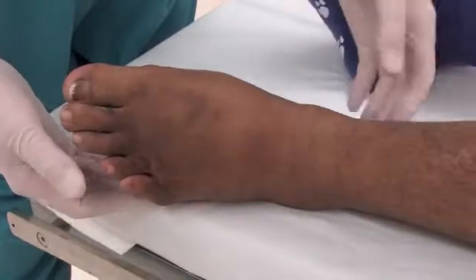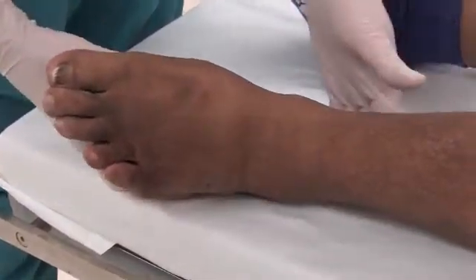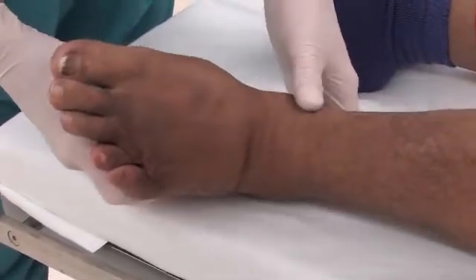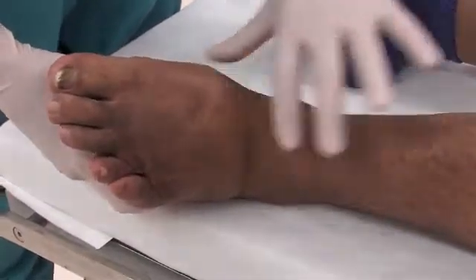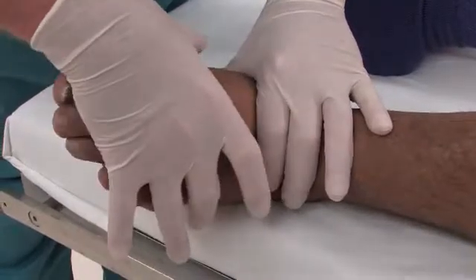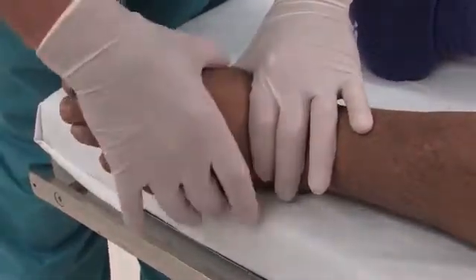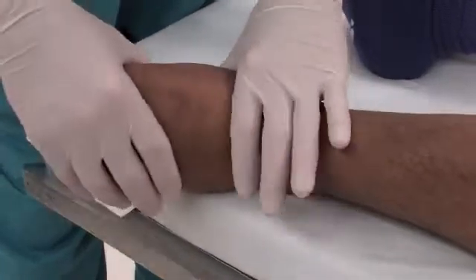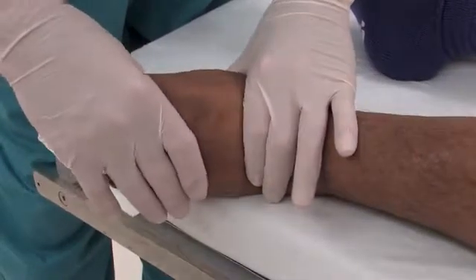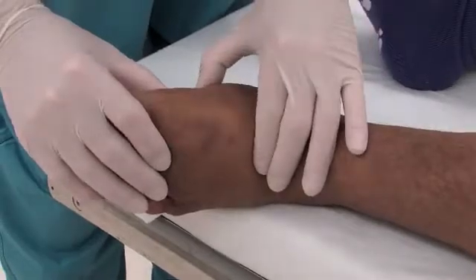The plan for today is twofold. One, we'll start with a soft tissue release, lengthening the Achilles tendon. Once we lengthen the Achilles tendon, we'll be able to then put our ankle into a neutral position. With our ankle and our leg locked in the ring, we'll then put the forefoot position on, where we'll actually displace it distally, plantar flex it, and compress at the fracture dislocation site. The idea here is if we can get this anatomically aligned with circular fixation, he'll have his best chance of healing this severe fracture dislocation.